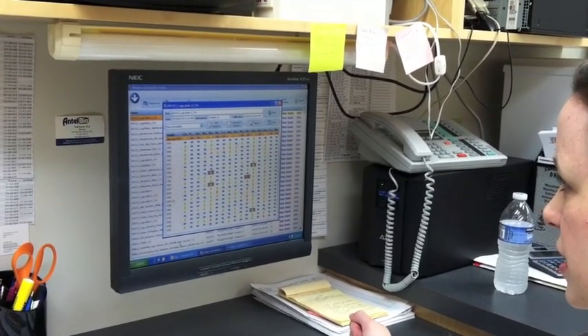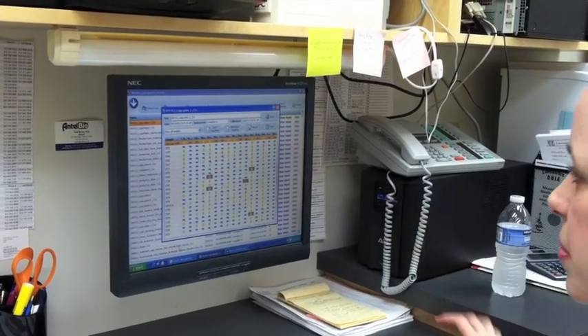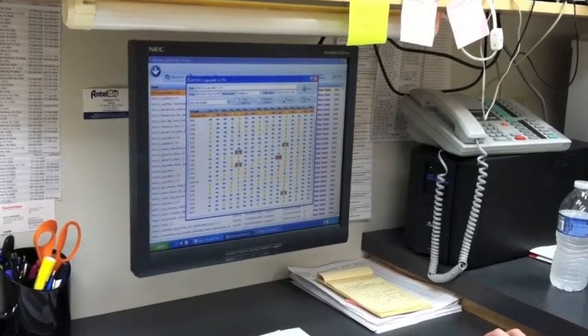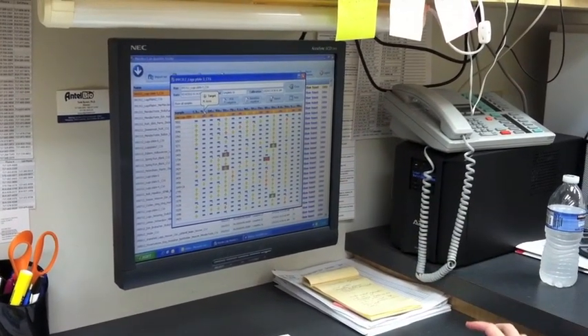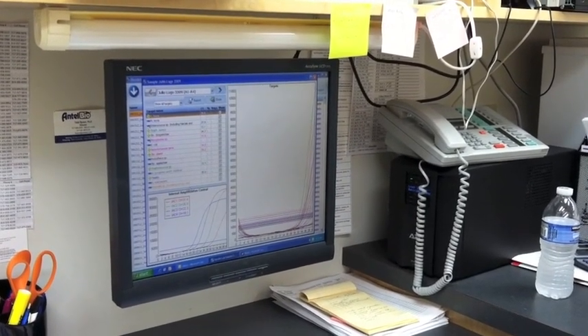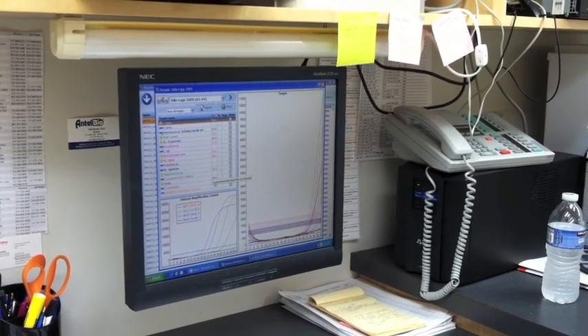The 16 bacterial targets are listed across the top. If I click on one individual sample, I can see what the results are for that individual sample.